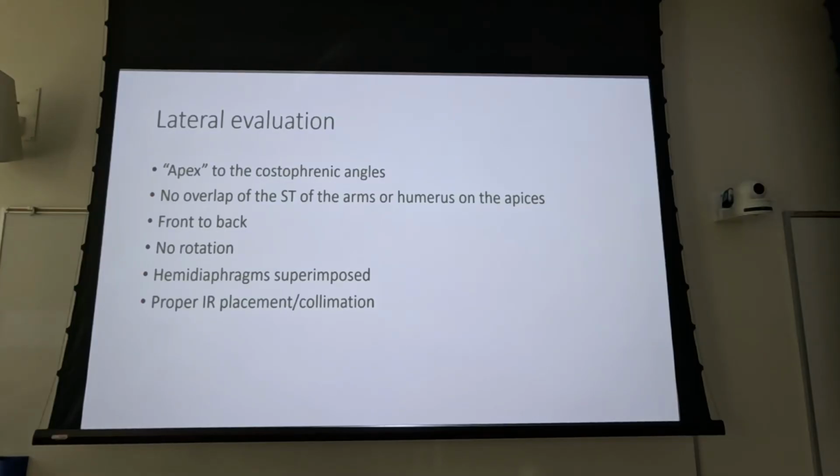And if you have somebody who's sthenic, and especially somebody who's hyposthenic, then they take in a breath and they just expand in every dimension, and it goes on forever. Their lungs go out to their fingertips and all the way down to their knees. And if you're using a 14 by 17 size image receptor, good luck, really, because with somebody who's got that hyposthenic body build, your positioning has to be almost perfect in order to visualize.